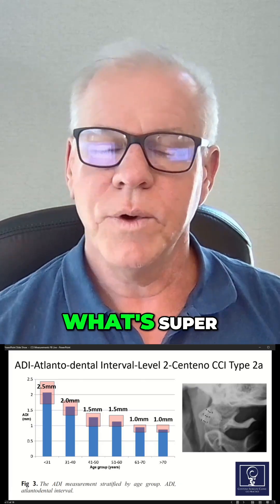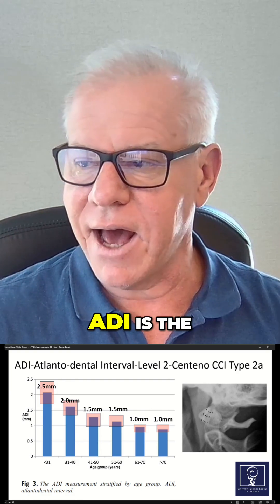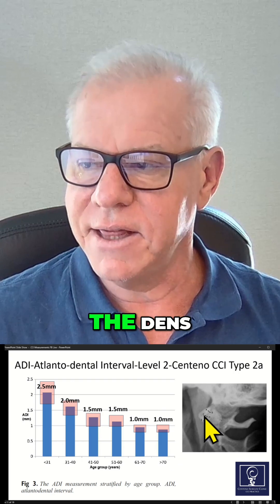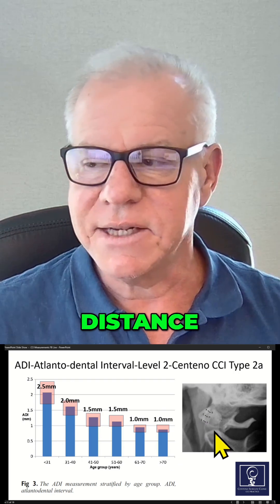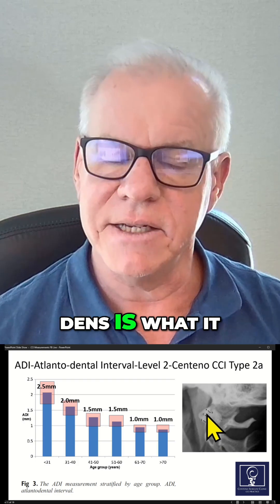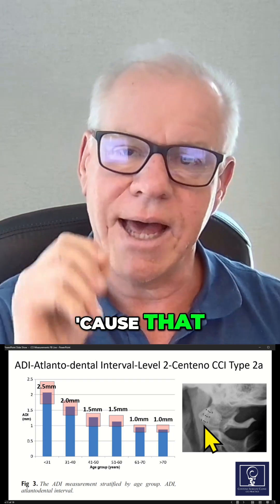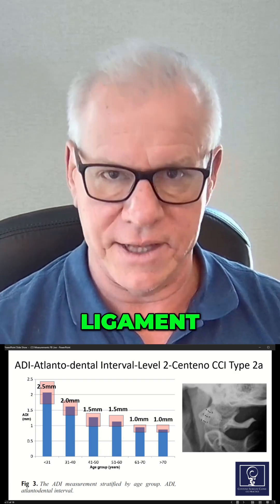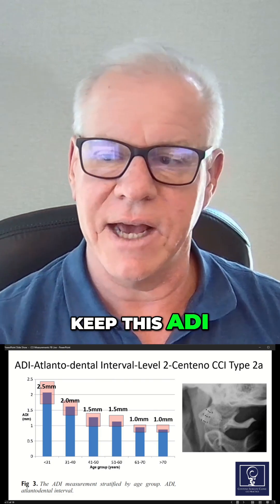Notice what's super fascinating about this measurement. Remember, ADI is the distance between the atlas and the dens, and it's being measured right here. That distance between the atlas and the dens is what we're measuring, and normally it's measured in flexion because that stresses that ligament — this is the transverse ligament that helps to control or keep this ADI small.